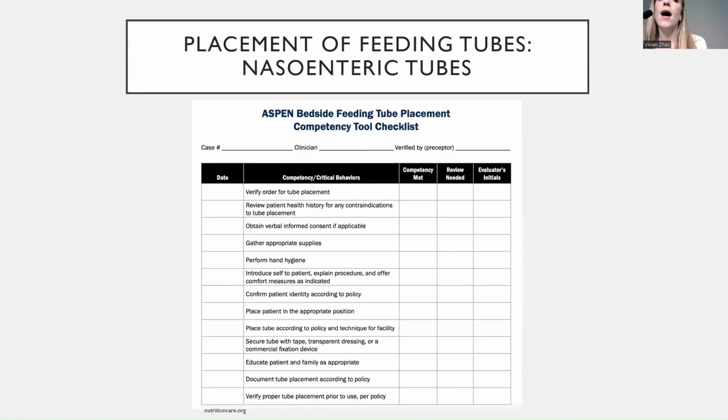ASPEN luckily has a bedside feeding tube placement tool checklist. Just quick show of hands. Do any of y'all place feeding tubes, or have you ever? Okay, perfect. And so I know it's not something that's super common for dietitians. I know nurses are usually the ones who do it, but I feel like nowadays with nutrition support teams, it is something that's becoming more common. So luckily, again, ASPEN has this lovely checklist to kind of streamline everything and make sure you check off everything.